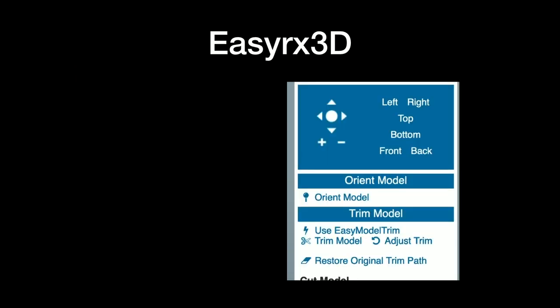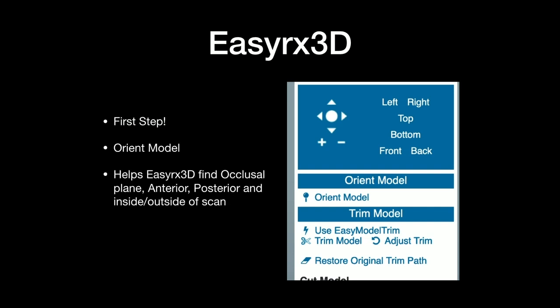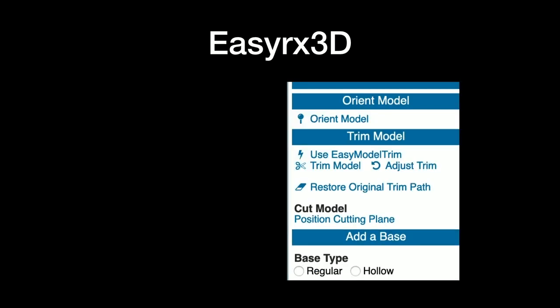Now the first step, and it's just very simple, is you orient the model. That helps EZRX find the occlusal plane. It's three dots: left molar, between the centrals, right molar. And it makes a triangle. And it figures out from that which side is the occlusal side, where's the anterior, where's the posterior, and where's the inside and outside of the scan, because as you know, the 3D scans are open scans. And it uses the coordinates for the rest of the steps. So I'll get to that in a minute.